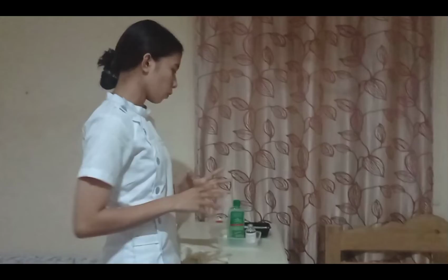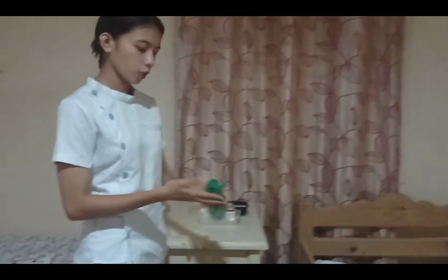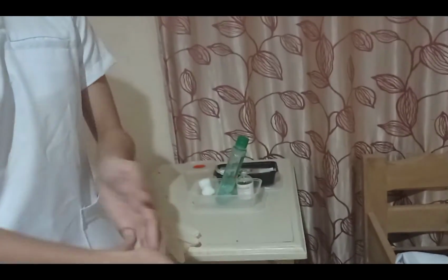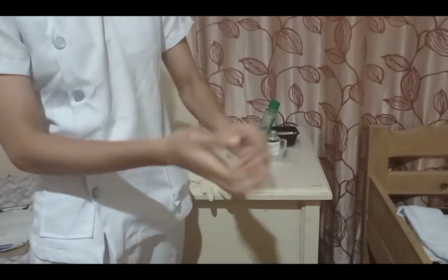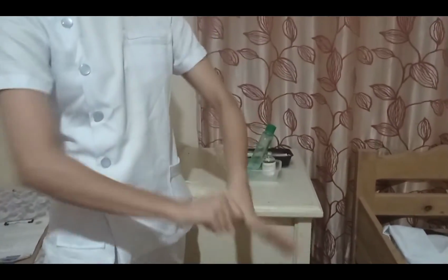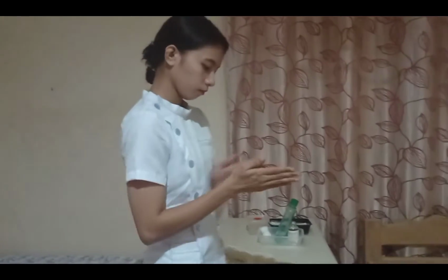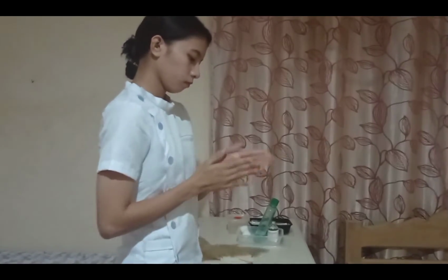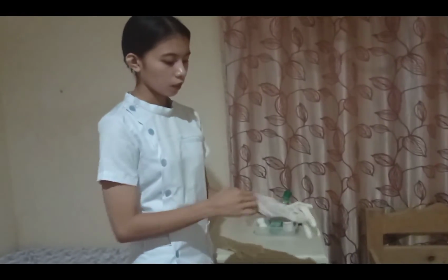Next thing is to do again the hand hygiene using the alcohol-based hand rub. Next is to don the non-sterile gloves.